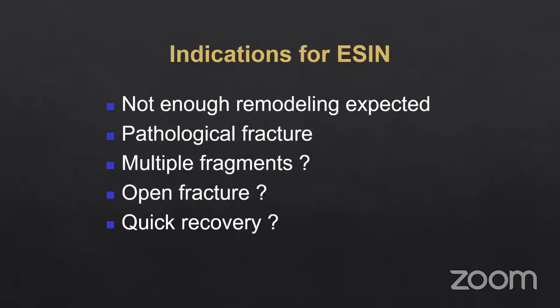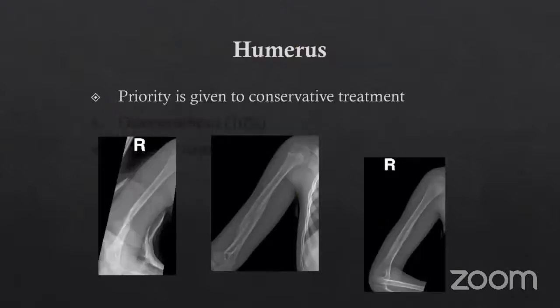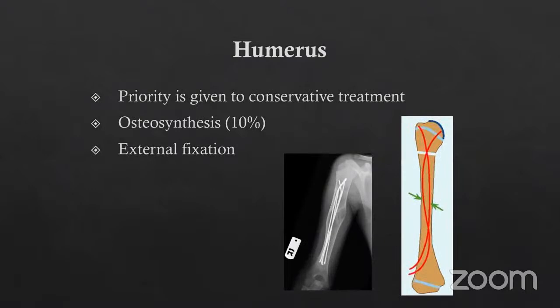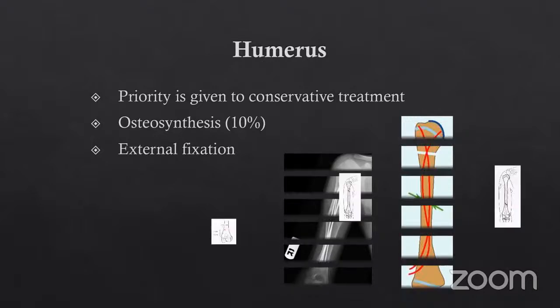Indications for nailing: pathological fracture, multiple fragments, open fracture, not enough remodeling expected, or where a quick recovery is required. Right? Humerus, as I said, priority is conservative treatment, osteosynthesis only 10% of the time, external fixation rarely. Most of the times it's conservative treatment and healing is never an issue. Elastic nails can be used in the divergent fashion in upper third or with the spindle in the diaphyseal region. You don't need to put multiple pins like this.